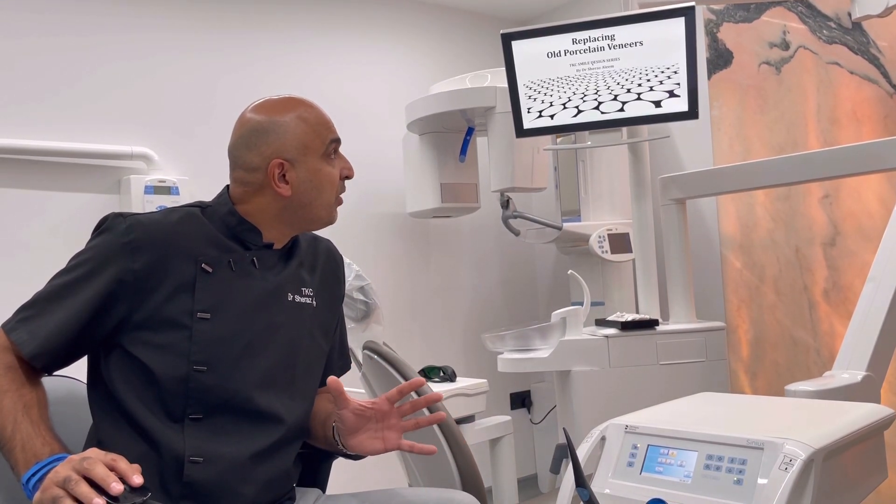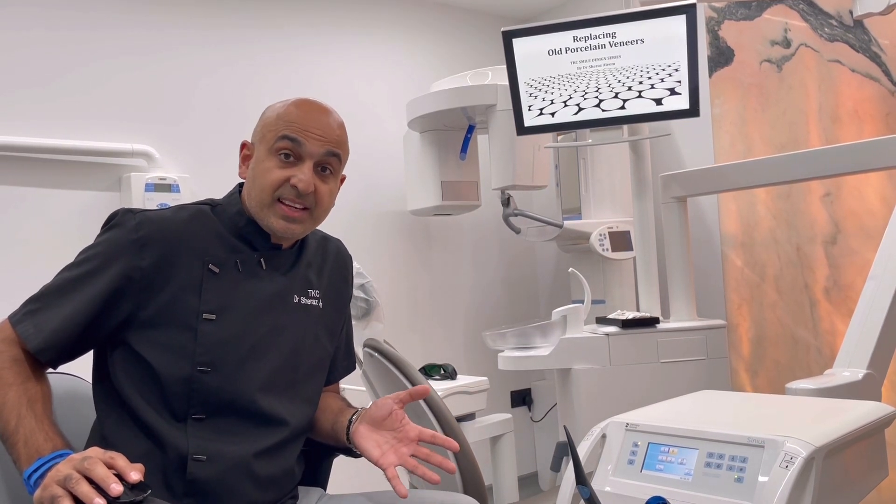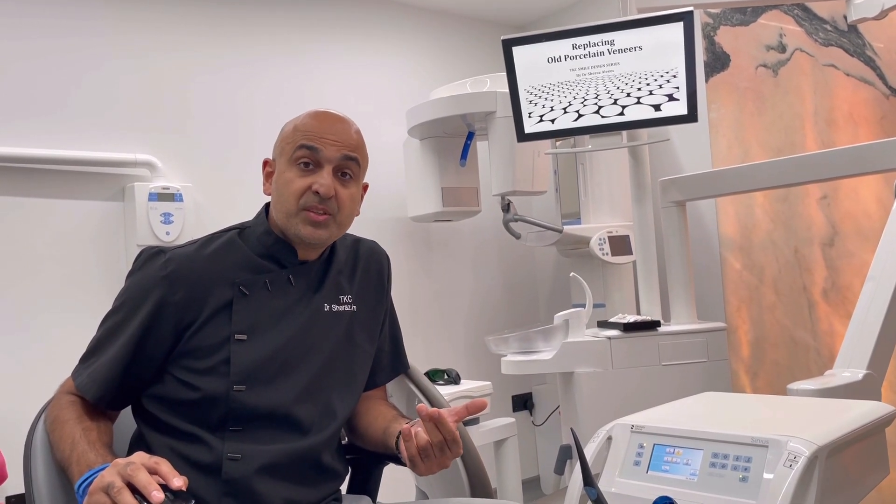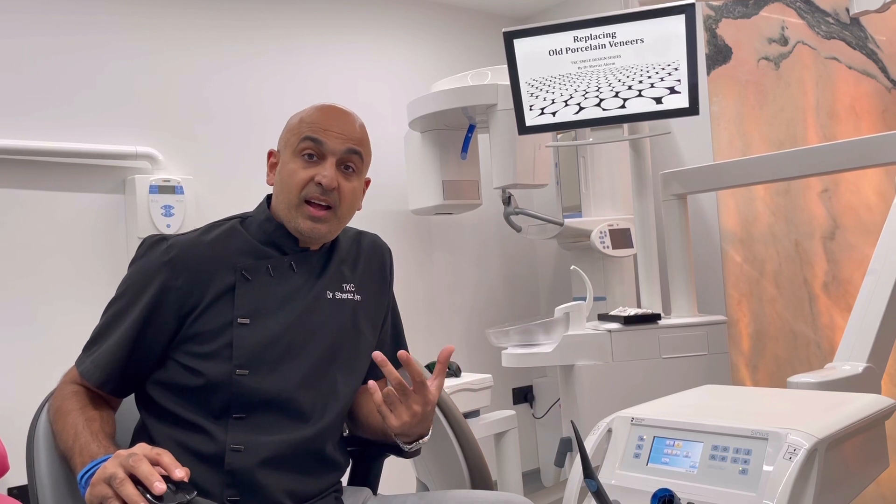One of the things we use on all of our replacement porcelain veneer cases is the Waterlase — probably the best thing I've used in the last 10 years. If someone asks what I hate most about replacing someone's work, the answer is taking off old veneers, because it can take hours. If you don't want to touch the patient's tooth underneath, it takes forever — removing ceramic is very difficult because it's hard to distinguish ceramic from tooth. Before I had the laser, these cases weren't enjoyable because removing veneers is stressful and time-consuming, but since having the laser it's a dream.